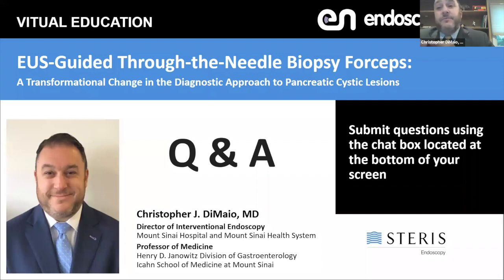So again, I think there's room for a lot of nuance with how we manage these patients, but I think the data will speak for itself. I think the two biggest factors with doing this are safety and cost, because now you're adding another tool to a needle cost. Those things need to be worked out, but the next set of studies will probably focus on cost analysis: if you spend X amount of extra dollars to do a biopsy forceps, you're saving hundreds of thousands of dollars in MRCP costs and EUS costs down the road. It's just a matter of time until those studies are published.